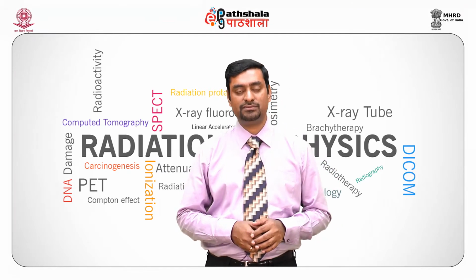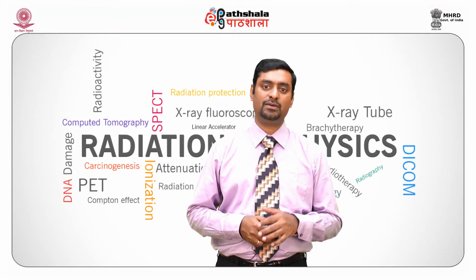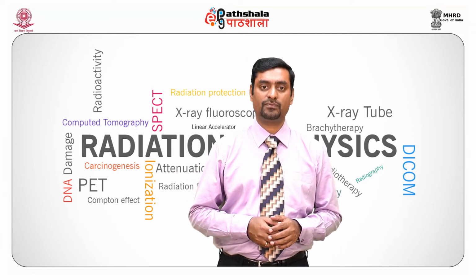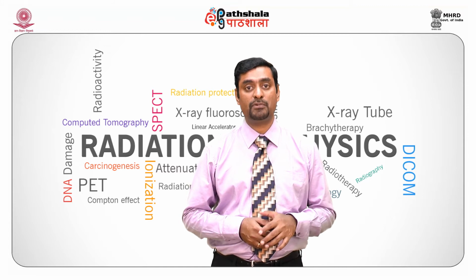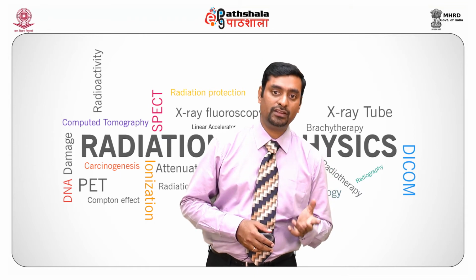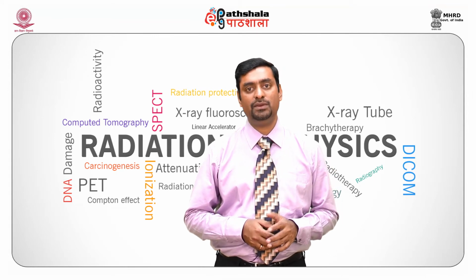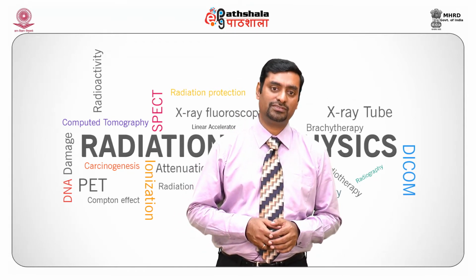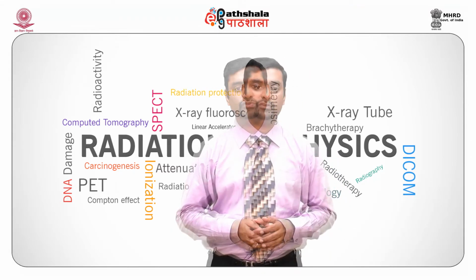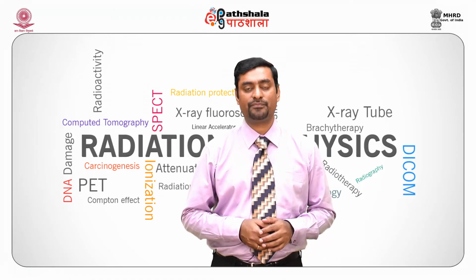In traditional mammography systems, non-screen cassettes or non-screen films are used, or in some cases single-sided emulsion film with a single-sided intensifying screen is used as an image detector. Films have high spatial resolution compared to other detectors used in mammography. Computed radiography uses photostimulable phosphor. These are barium fluorohalides. The image resolution may be about 50 microns. Then we move on to the slot scan mammography system, which acquires images using a narrow fan beam of X-rays falling on a series of CCD detectors.